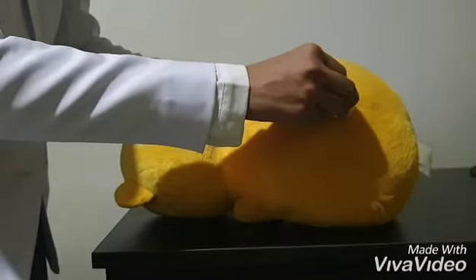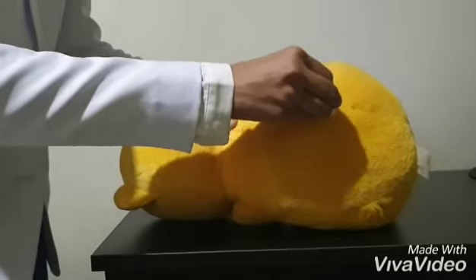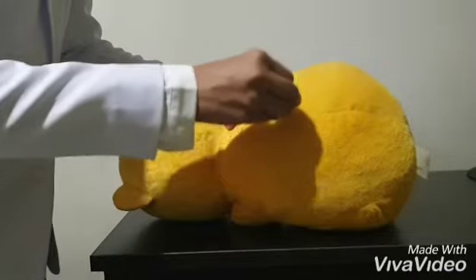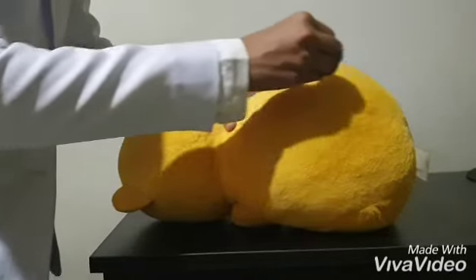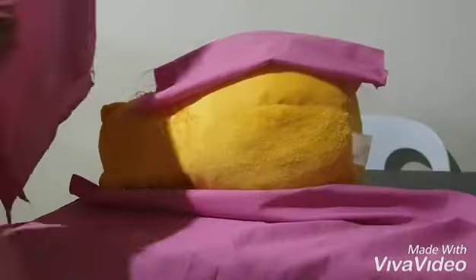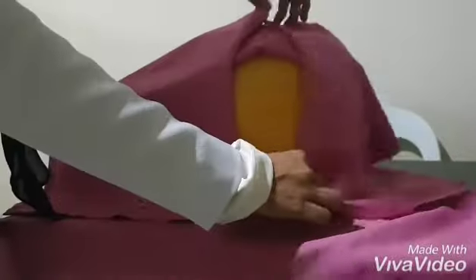Cleaning of the site should be performed in a circular motion, working from the inside out. Clean well beyond the area you will drape with chlorhexidine or betadine. Repeat it 3 times. Place your drapes so as to create an opening through which everything is sterile.